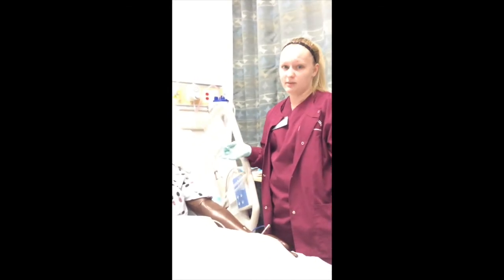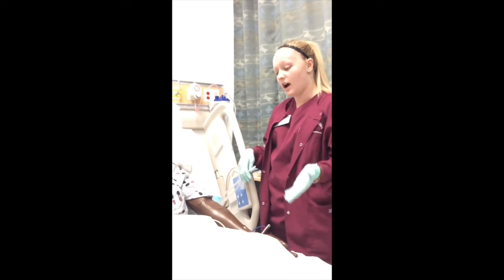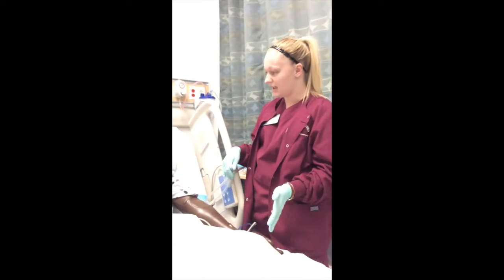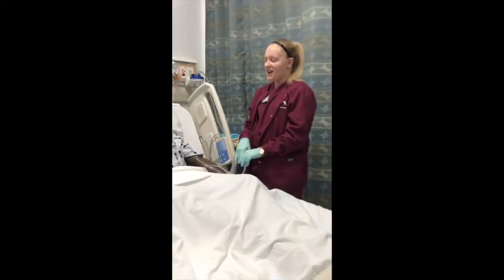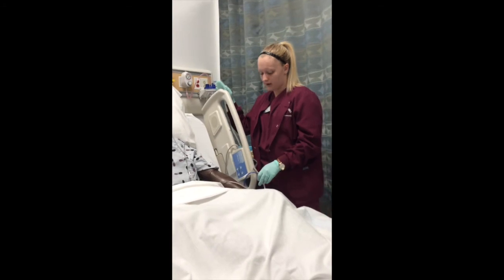But if not, after I've already confirmed that yes, I need to take the NG tube out of this patient, I can go ahead and come to the bedside. Knock, knock, knock. Hi, my name's Dusty. I'm going to be your student nurse today. Can I get your name and date of birth? Thank you. And do you have any allergies or are you in any pain? No to both? Okay, great.